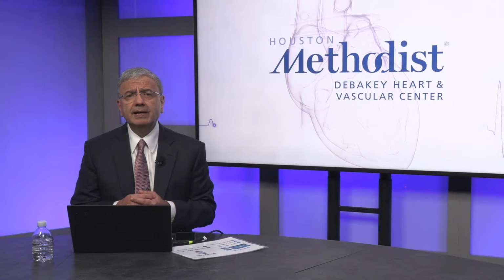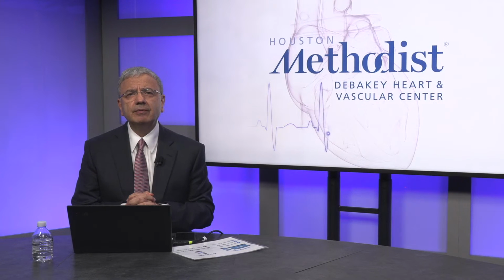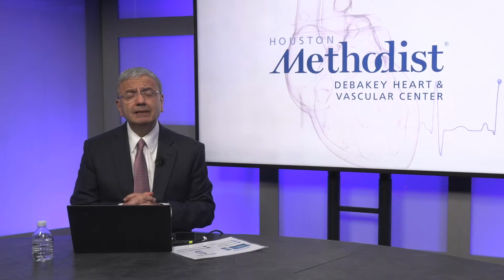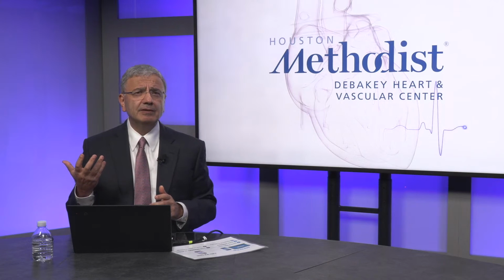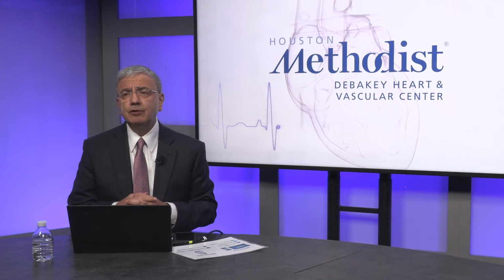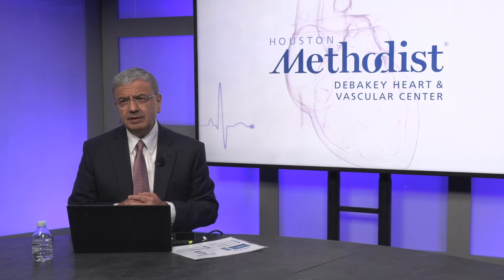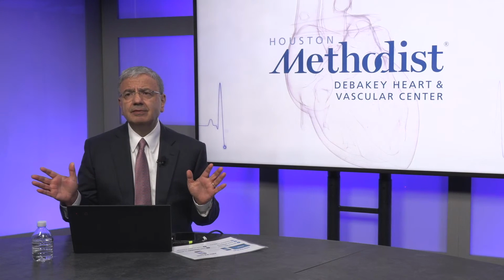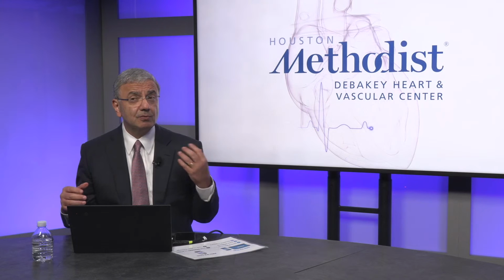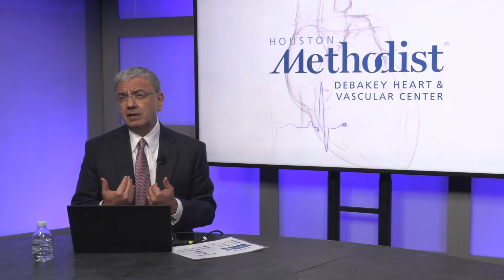What role do audio and light play with frequencies? I'm not understanding that particular question, but I'll try to flip it one way or another. In the past, we used to have audio during recording of these. We used to be able to split the audio as the one coming towards you versus the one going away from you. Nowadays, audio for our interpretation is not as important.